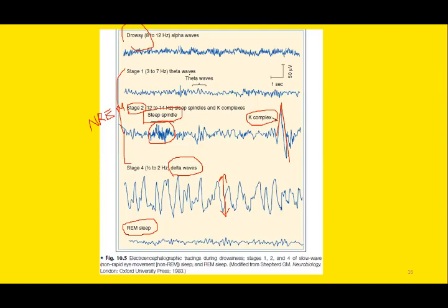And stage 1 is characterized by theta waves. Theta waves are of relatively low voltage and medium frequency.